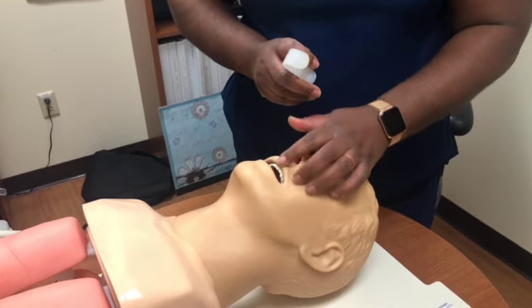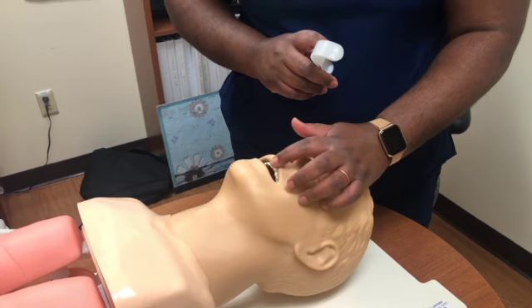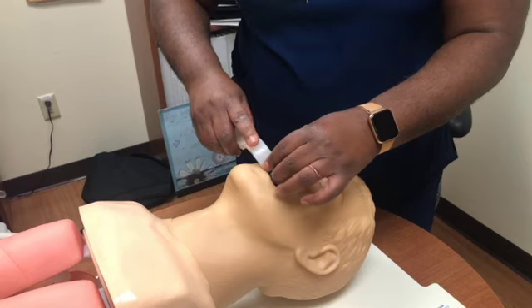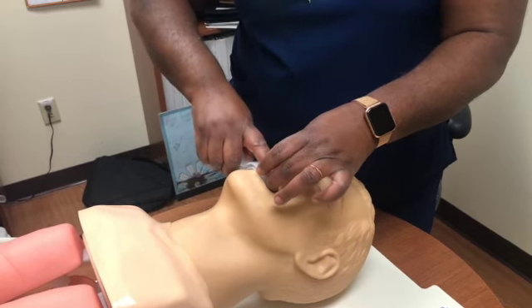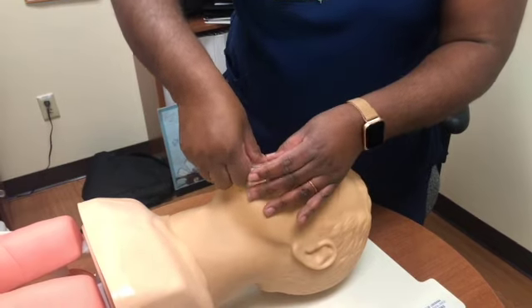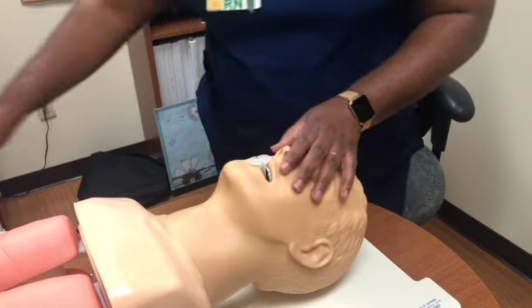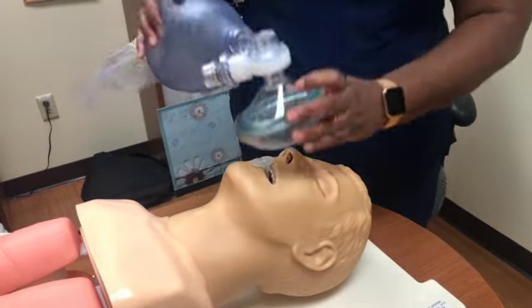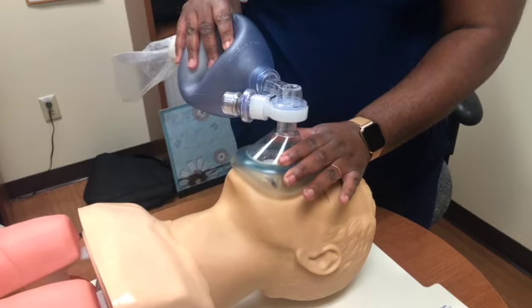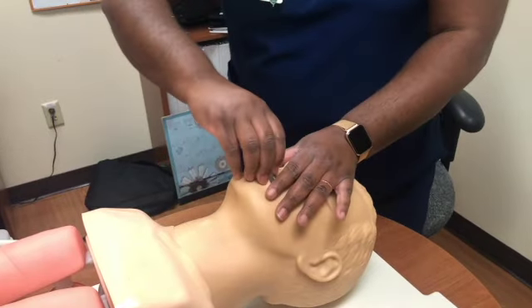When inserting, be mindful if the patient has caries or broken teeth, because it could cause further damage. When we're putting the airway in, we're going from the side, then we're going to flip. The airway is designed to hold the tongue back and away, so they have an open airway. This is only used on unconscious patients.